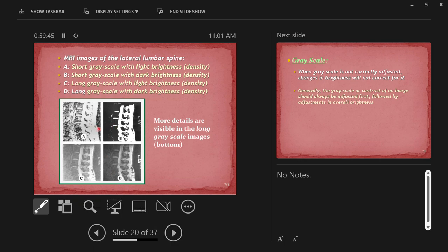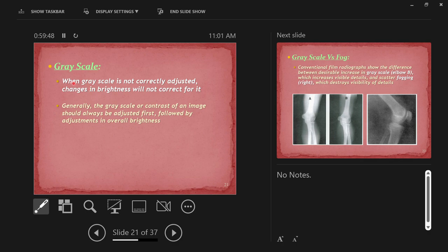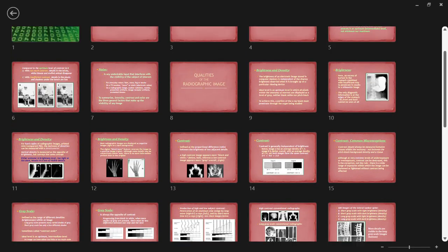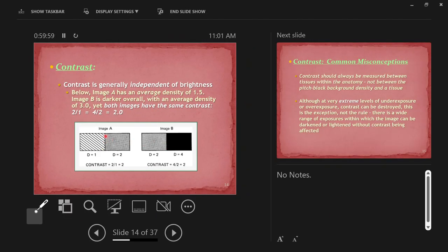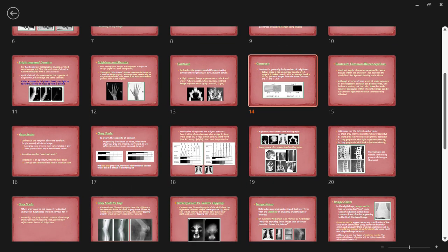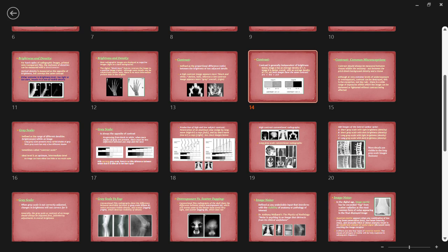Contrast and brightness are largely independent. Images A and C are both light images with different contrast: A is short scale high contrast, C is long scale lower contrast with more shades of gray, even though both have similar brightness. Images B and D are both dark, with B being high contrast and D being low contrast — D has more information because of the longer scale of contrast. When grayscale is not correctly adjusted, changes in brightness don't fix it — contrast and brightness are separate factors.